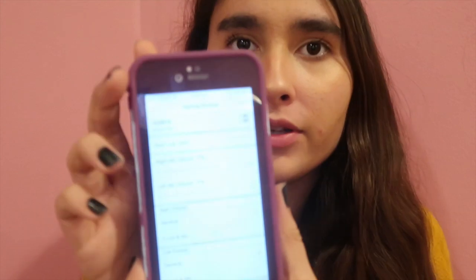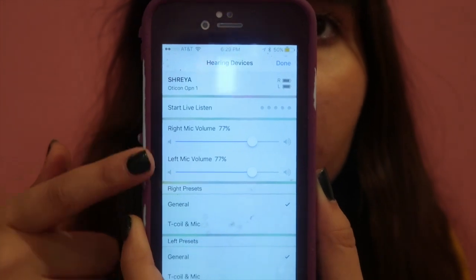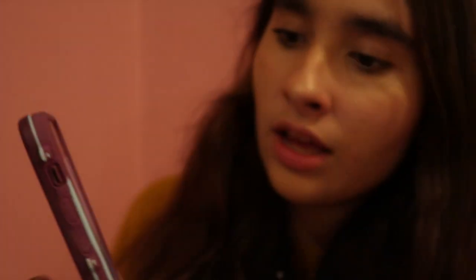Triple-click the home button and you'll get a screen that says Hearing Devices, then your hearing aid name. It'll show the battery level up top and volume levels. I've noticed I sometimes have to do this a couple of times for it to register all the settings. It shows the name, Oticon OPN 1, and the volume — it always starts at 77% for me. I find that at 100% it's way too loud, and at 0% I really can't hear anything at all.